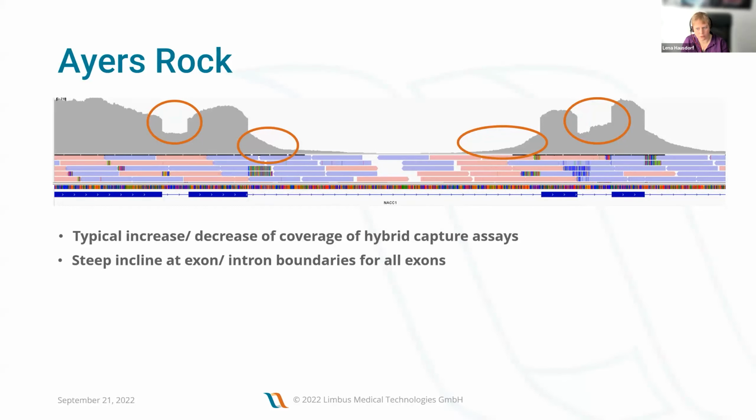You don't have to pay extra for fast report, by the way. We will answer within 1 day, regardless of how much you pay. And there are no additional costs unless you want long-term storage. In that case, you have to pay for the storage. We just give the prices for the storage of the cloud. But that's it.